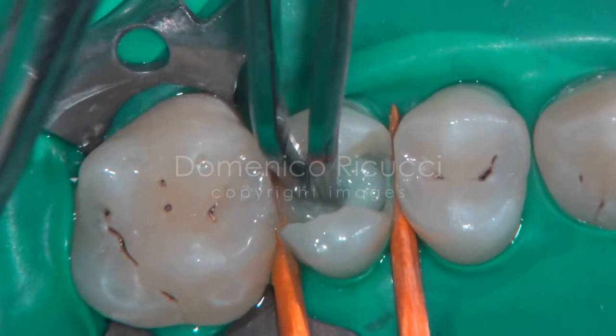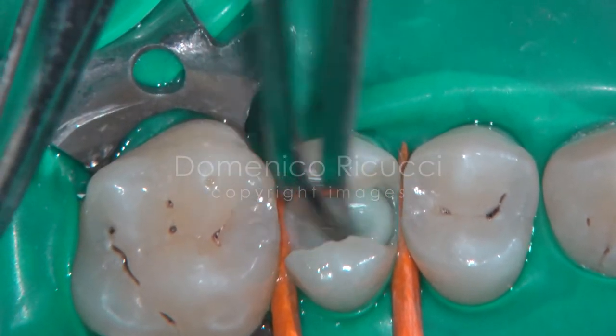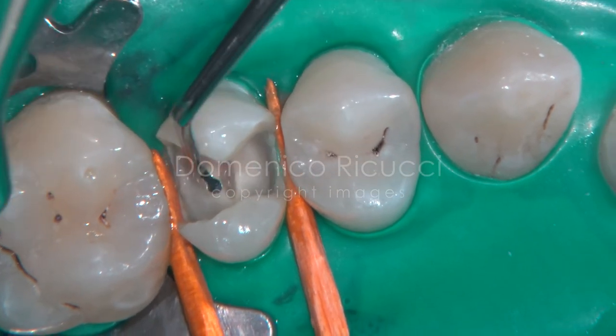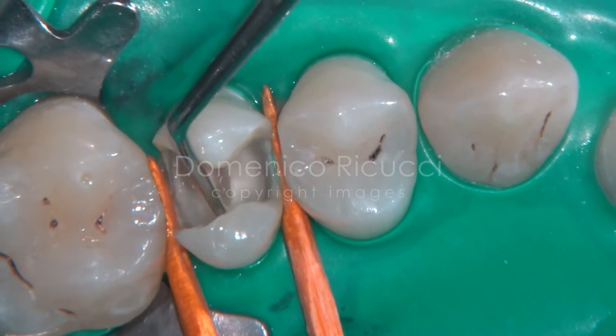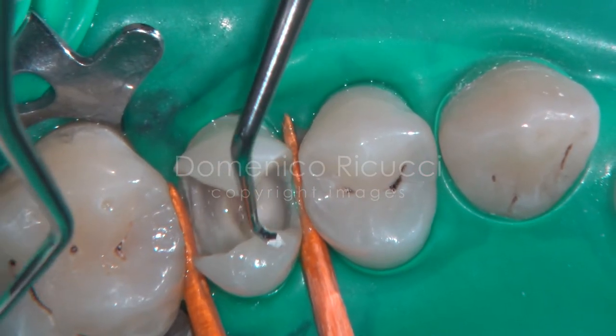The cavity is disinfected with a chlorhexidine solution. Particular care is taken to remove tissue debris from the undercuts. Special micro-excavators are used for this purpose.